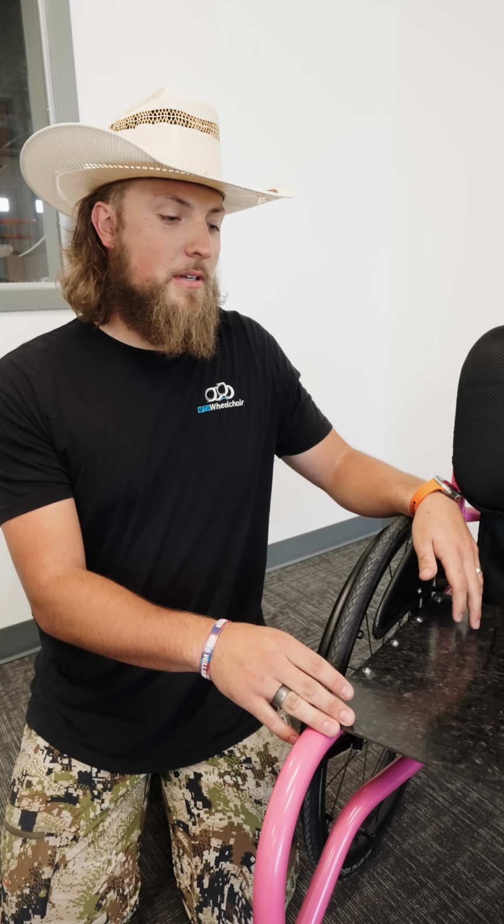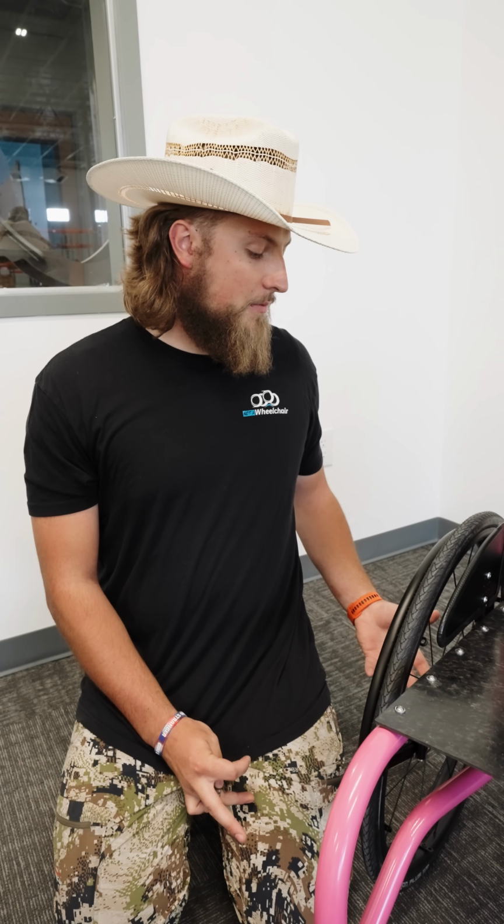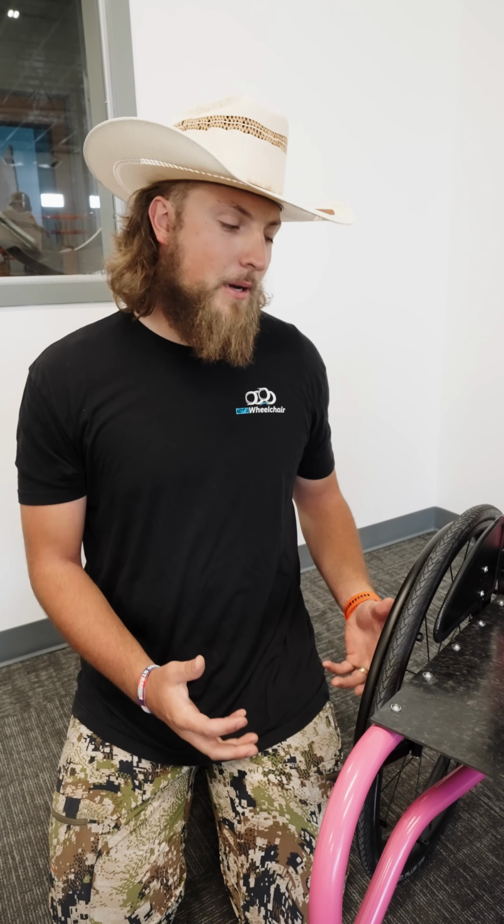We'll talk about two quick exceptions. The first one is being able to order new parts. For example, if you wanted a seat with a different seat depth, we could make you a new seat that could be retrofitted onto your wheelchair. Or same thing with your rear wheel camber. If you wanted to buy a new axle with different camber inserts, that could be done on your wheelchair.